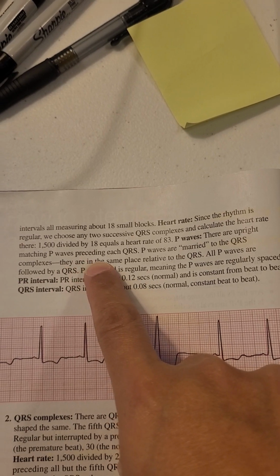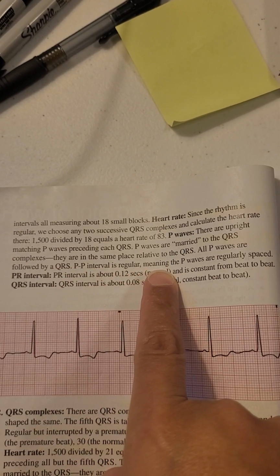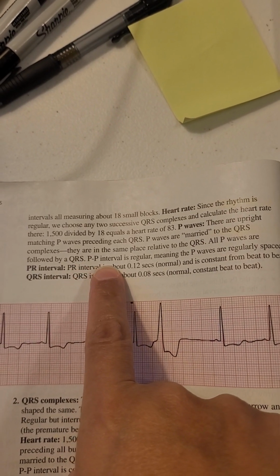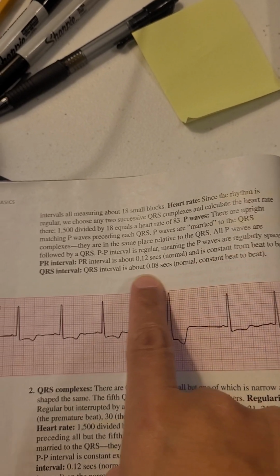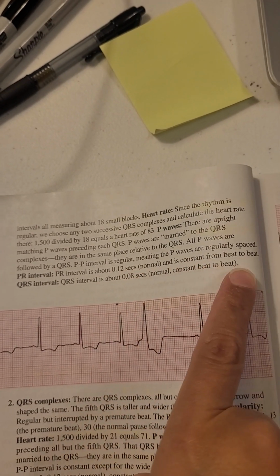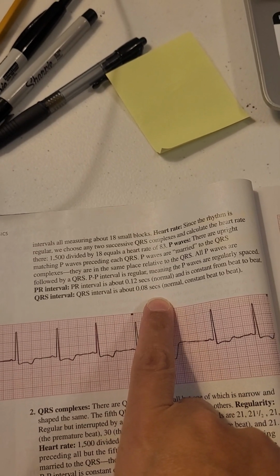Matching P waves preceding each QRS. P waves are married to the QRS complexes; they are in the same place relative to the QRS. All P waves are followed by QRS. The P to P interval is regular, meaning the P waves are regularly spaced. The PR interval is about 0.12 seconds, normal, and is constant from beat to beat. And the QRS is about 0.08, so it's normal.